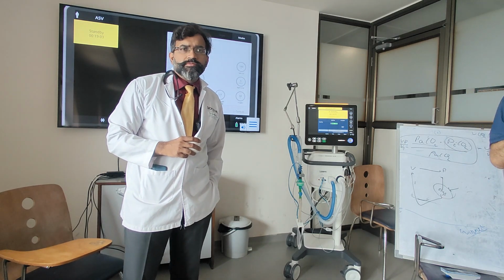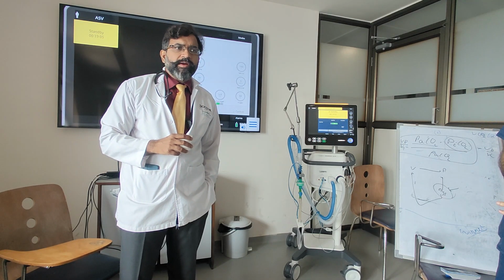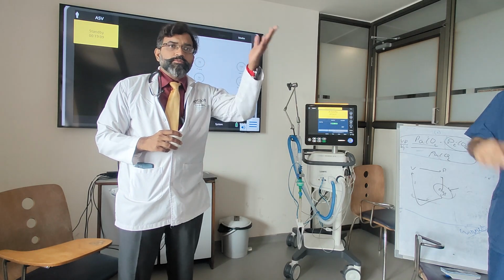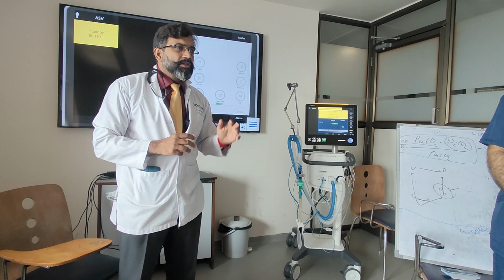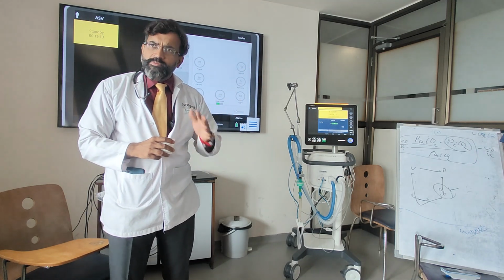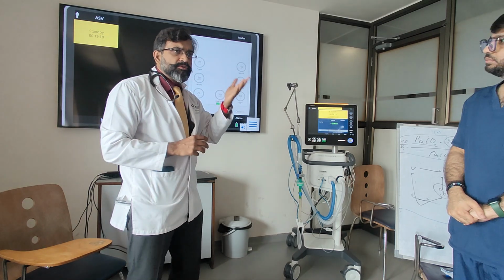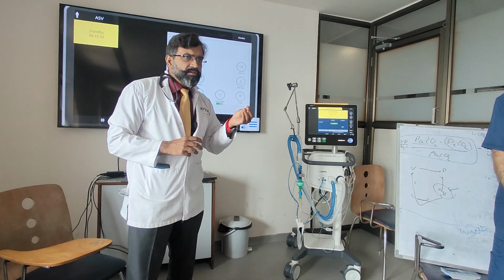What is asthma? What do you do? Asthma, COPD, what are you expecting? You're expecting hyperinflated lungs. So I don't want larger volumes. Simple? Because if I give larger volumes, I'll have problems. So what I will do in the minute ventilation, I will reduce it. I'll give it 80 maybe.